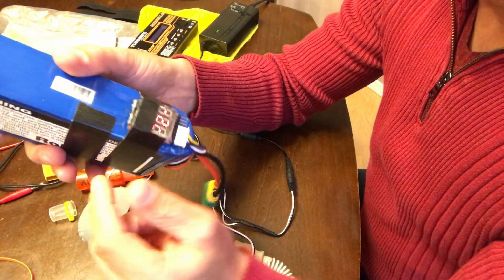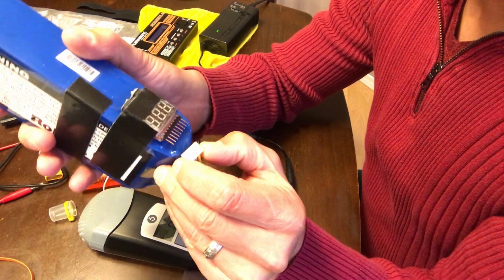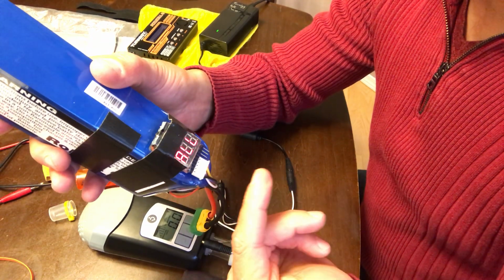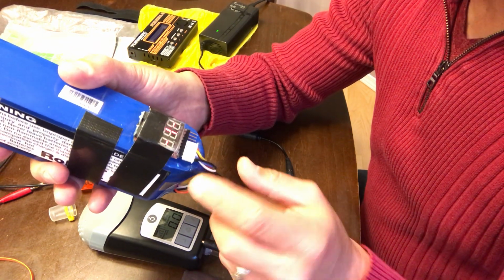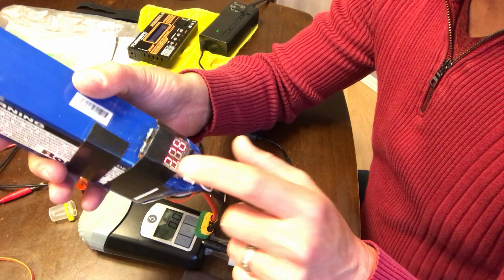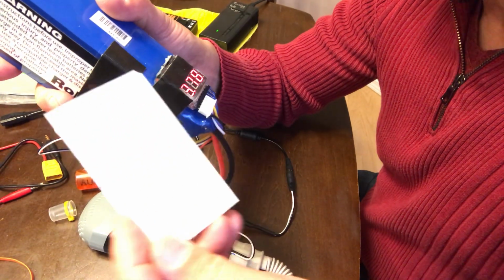they fry a battery. But I found that if I put that beeper in there with a little bit of hot glue, it's just quiet enough and loud enough to wake me up while I'm sleeping. And I would only use this when I knew I was getting close to 3.3. And I had done several tests to see how the battery drains.